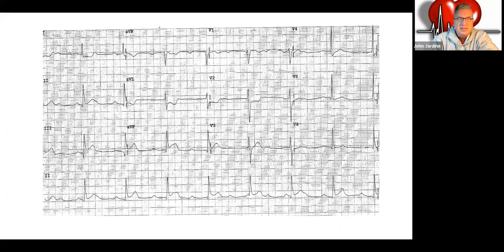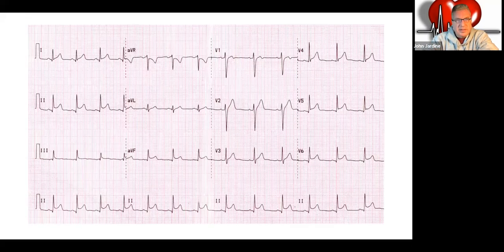If you look at these ST elevations here, particularly this one, well, that looks like a frown, right? So that's a frown, and that's down, so that's a bad thing. If you look at these ST elevations, again, this looks like either pericarditis or early repolarization or something. You see that it's concave up, and then you have a smiling one. Again, I don't know that I'd put too much science here, but it could be hints to whether this is ST elevation in a bad way or not.